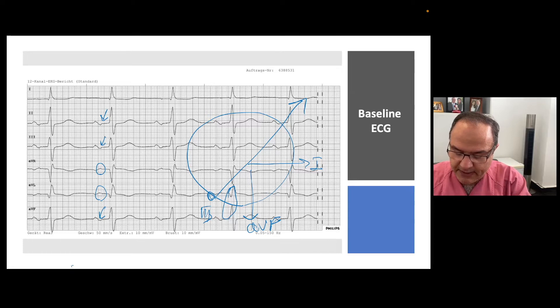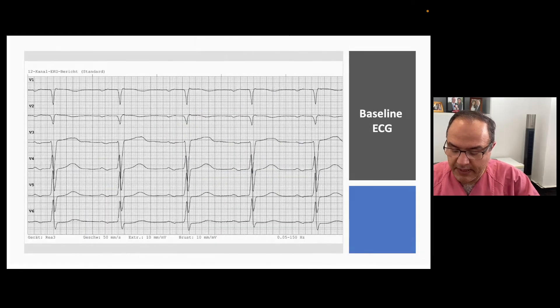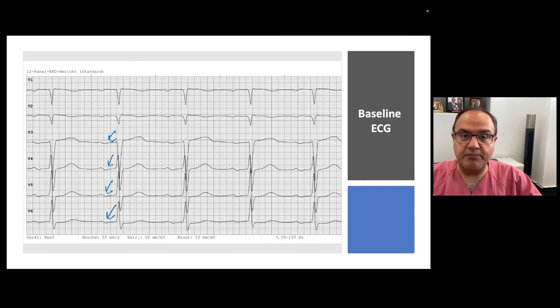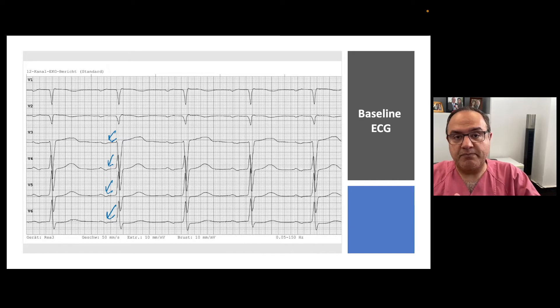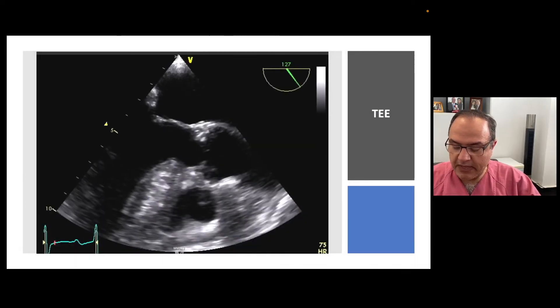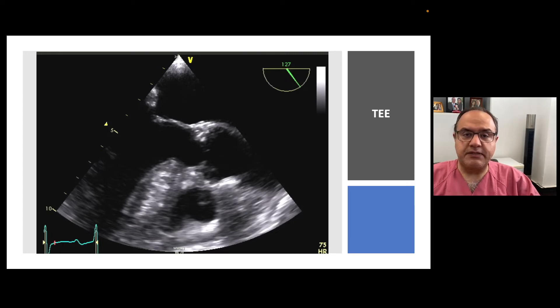Looking at the precordial leads — especially V3, V4, V5, and V6 — the left atrial component of the P wave is also negative, which is compatible with interatrial conduction through the coronary sinus.